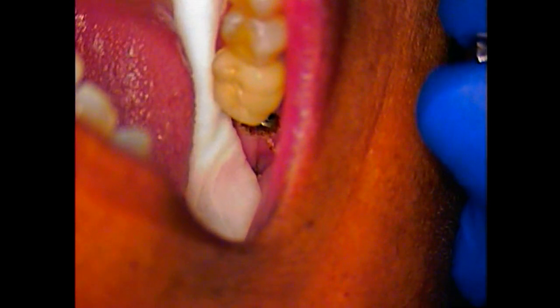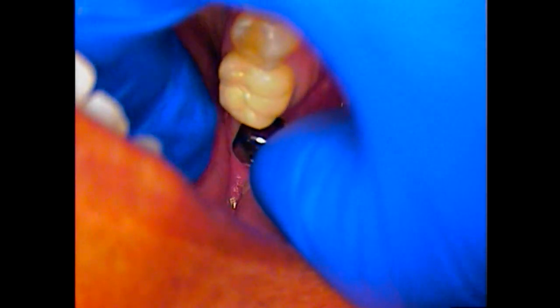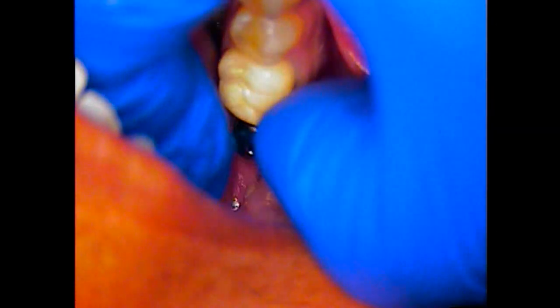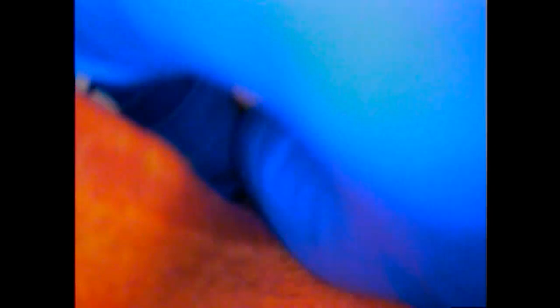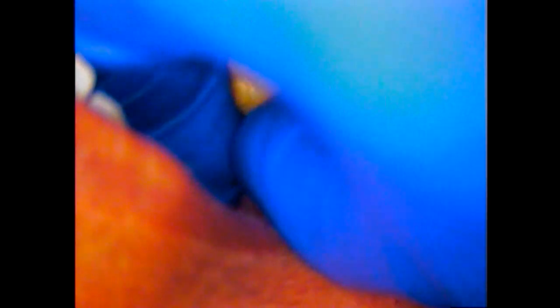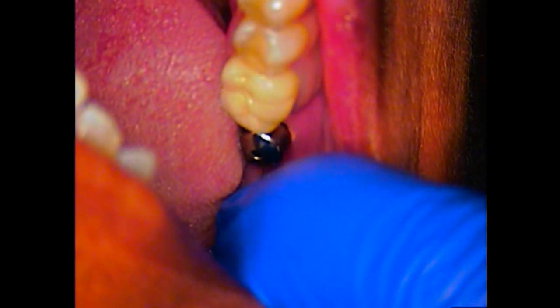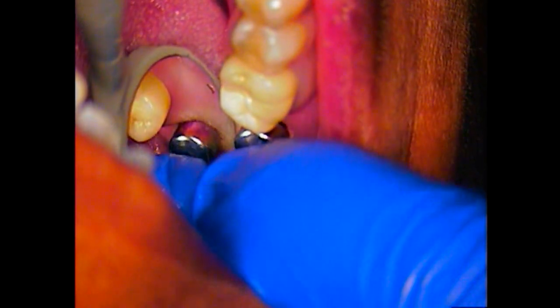We'll ask my dental assistant to remove the cotton roll. And we'll sneak right alongside the tongue. There it goes. And here it goes. And she's turning nicely right down inside. Looking all the way around. I think we'll do a little hand tightening.